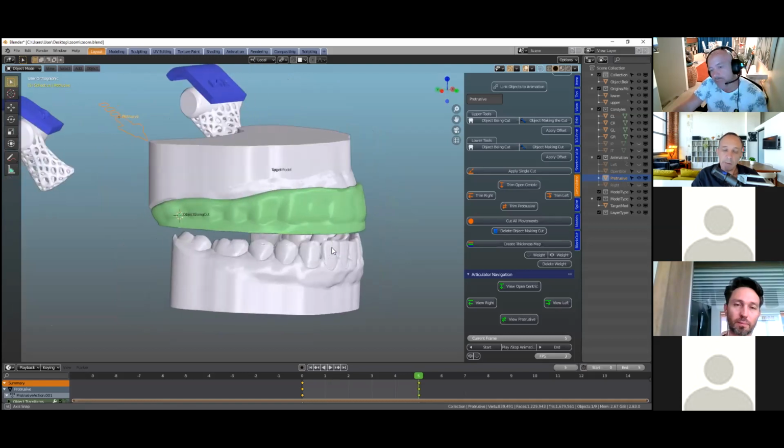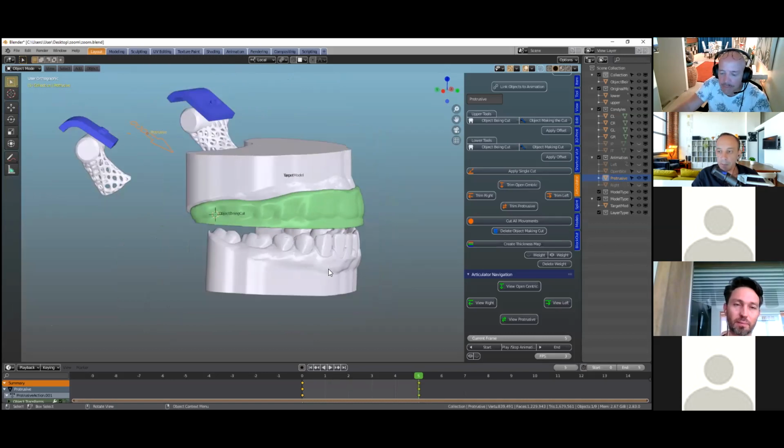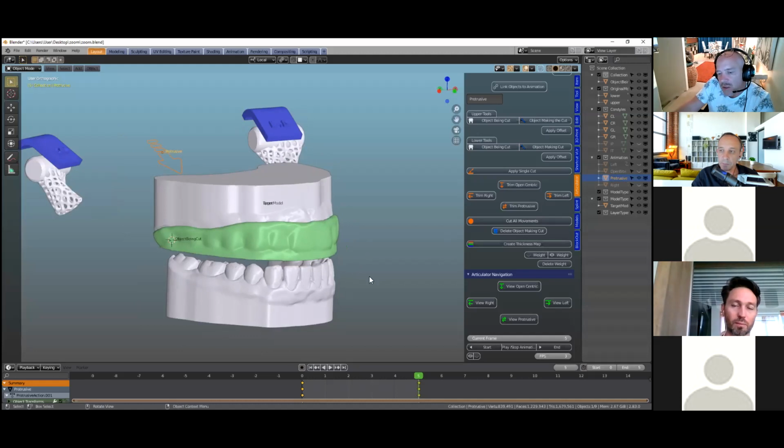So Michael, if you have a buccal scan of the bite, say you're setting that in the chair, do we need the articulator module as such? Except, of course, you need it for making the occlusal adjustment at the end. How would you work around that one? Yeah, we've got a user that does that. They open the bite and then use the articulator just to put a few movements into it, but the opening of the bite they've done externally, outside of the digital.